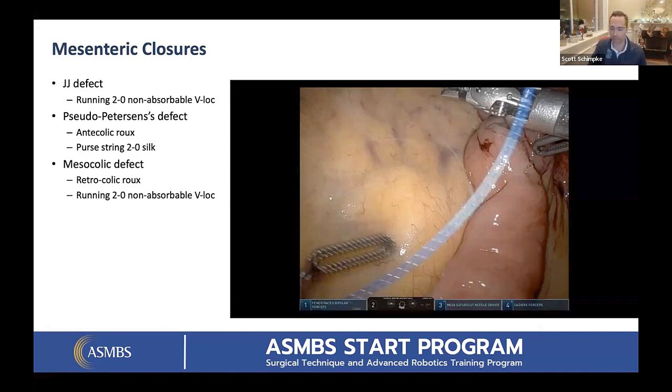I didn't put that video in there, my apologies, but yes, really, really important to maintain your orientation, make sure your mesentery is not twisted. Don't want to be doing Roux-en-O's or anything like that as well. So like Julianne said, that's the part of the operation where you do not want to be bothered. If you're running the bowel and someone interrupts you, or you lose track, you just start over. It's not worth it. Yep. Make sure that orientation is right.